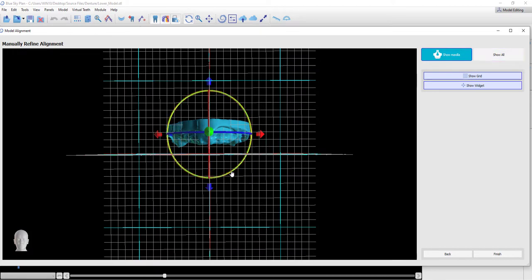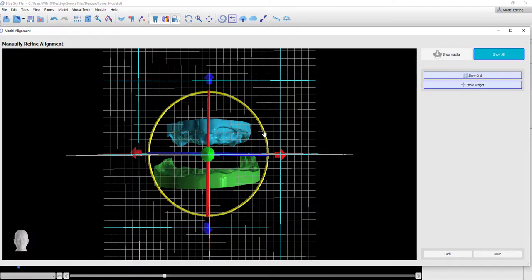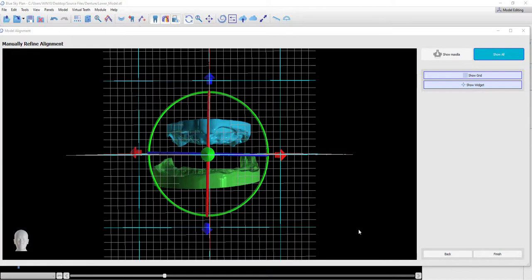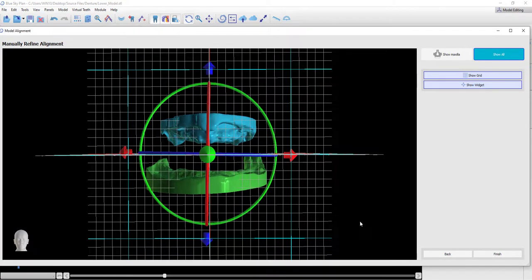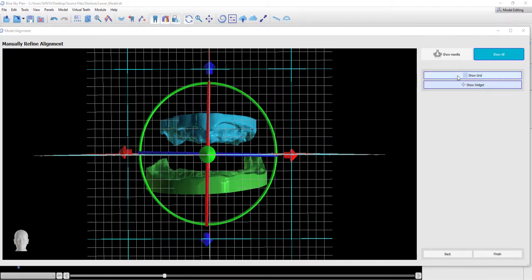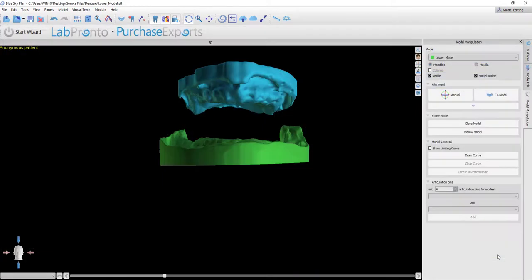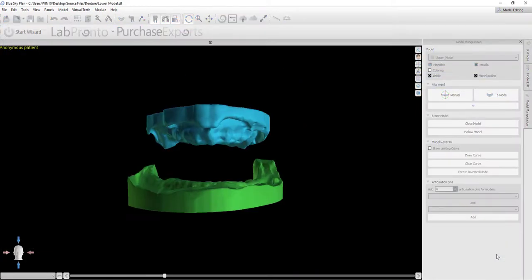We are able to orient the model on the screen, or we are able to click Show All and see all of our relevant models that we multi-selected, and then orient all the models together. The additional models have automatically been imported and oriented in the software based on the orientation of the first model where we selected. The toggle buttons allow us to toggle on and off the grid as well as the widget. Clicking Finish will load the models.